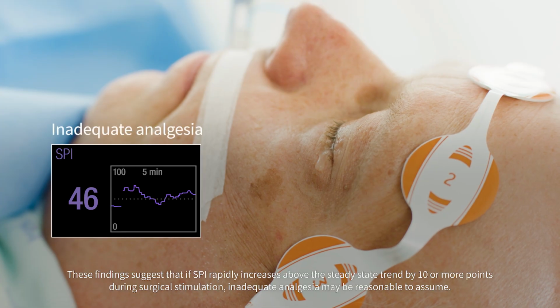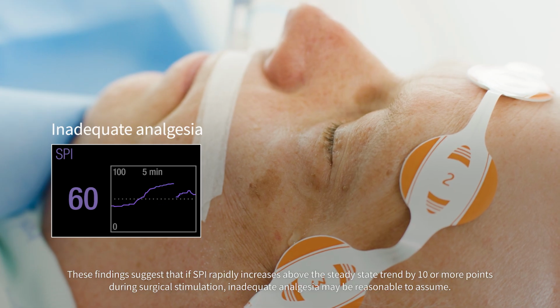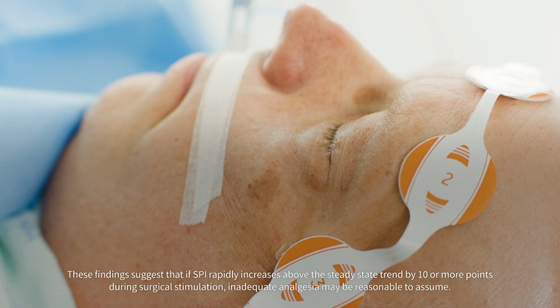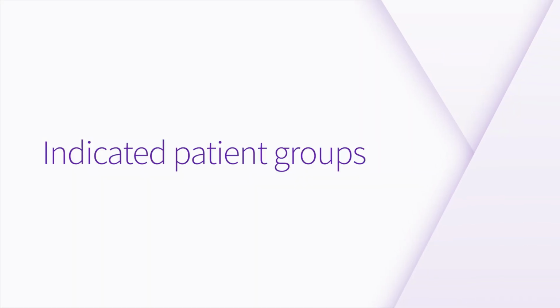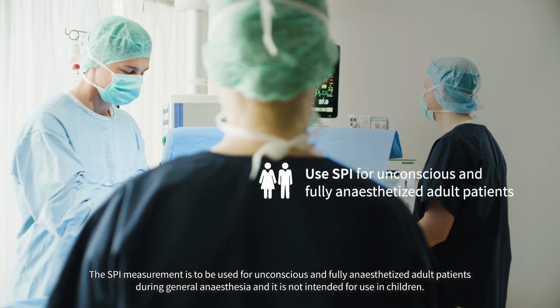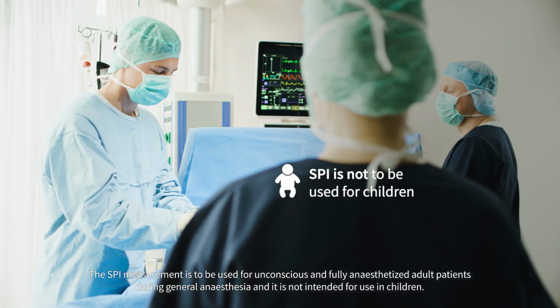These findings suggest that if SPI rapidly increases above the steady state trend by 10 or more points during surgical stimulation, inadequate analgesia may be reasonable to assume. Nociceptive balance may therefore be re-established by immediately readjusting the opioid dosage. The SPI measurement is to be used for unconscious and fully anesthetized adult patients during general anesthesia, and it is not intended for use in children.